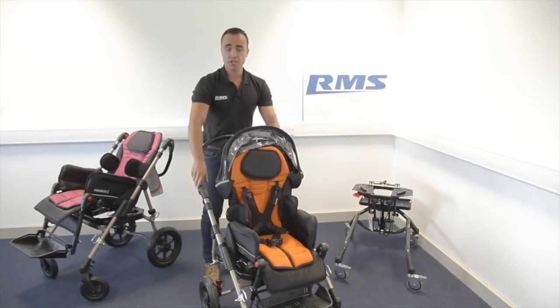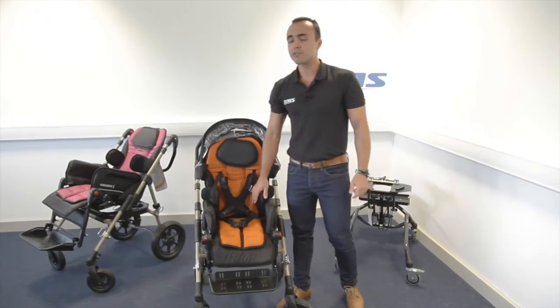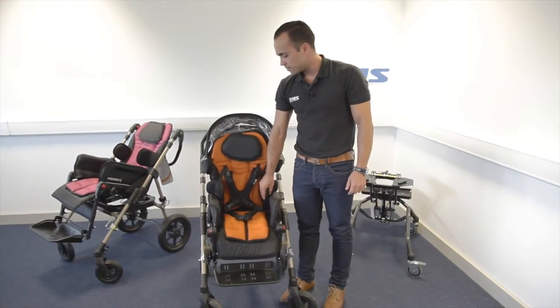The frame has adjustable push handles. You have four different upholstery colors: orange, blue, pink, and yellow.